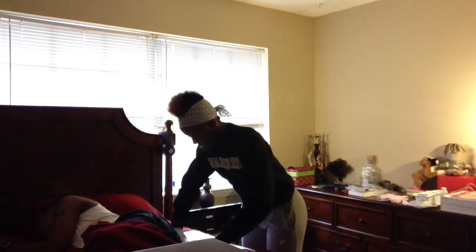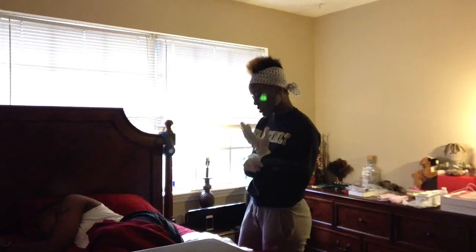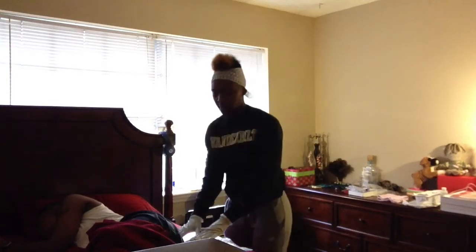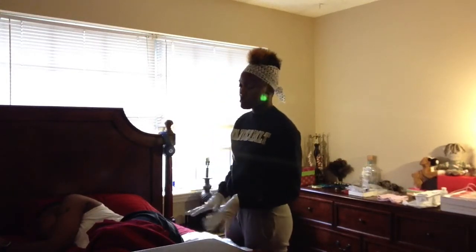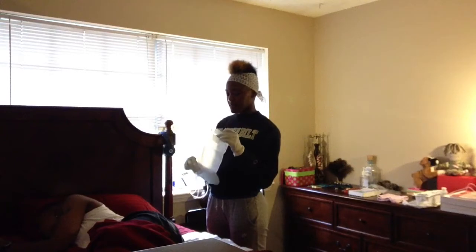I'm going to place this protective sheet under Sophia. I'm also going to place the bedpan there because Sophia expressed to me she has some limited mobility, so we're not going to get her out of the bed. I want to pour in the soap concentrate. I also want to pour in warm water and get that all mixed up.